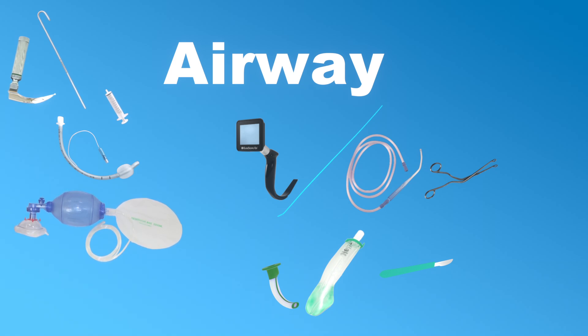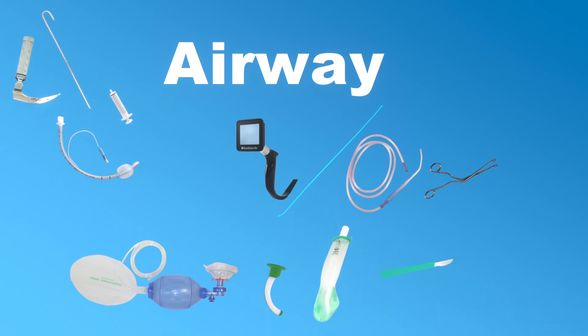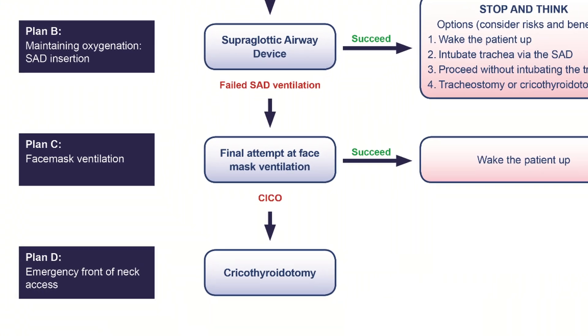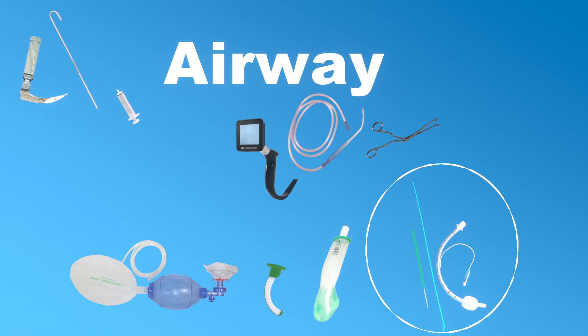If we can't get our tube into place on our first attempts we're going to need to bag mask ventilate the patient, and for that we use a bag valve mask with a fitting face mask attached to it. To make mask ventilation easier we may want to insert an oropharyngeal airway, and if we still can't ventilate or intubate, a laryngeal mask airway can save the situation. If we've optimized our intubation conditions but still can't intubate or oxygenate the patient, we've reached the end of the difficult airway algorithm and an emergency cricothyrotomy kit should be available — though that is really a last resort and a very rare occurrence.